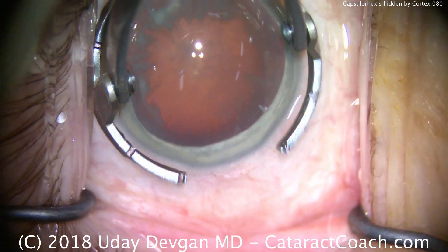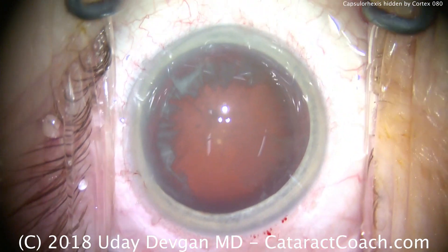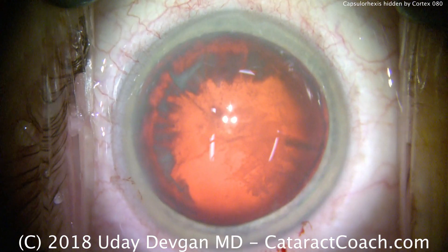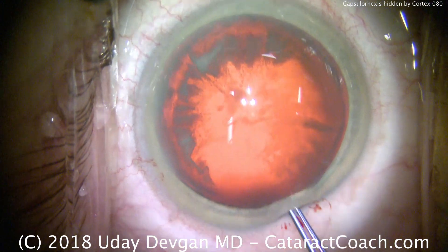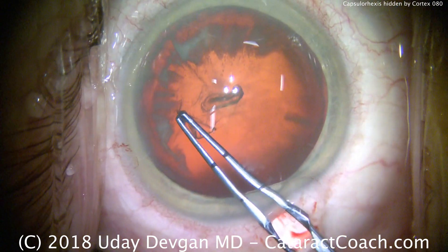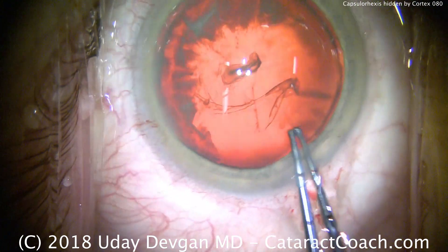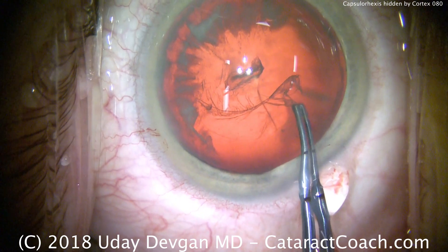We've made the main incision here. We're going to zoom in and adjust the lighting a little bit. We want to emphasize the red reflex lighting. Now it's primarily retro illumination with the strong red reflex. We'll start our capsulorhexis in the area that we can see, so let's do the inferior portion first. I'm measuring with the device just to make sure I know what five millimeters is going to be.